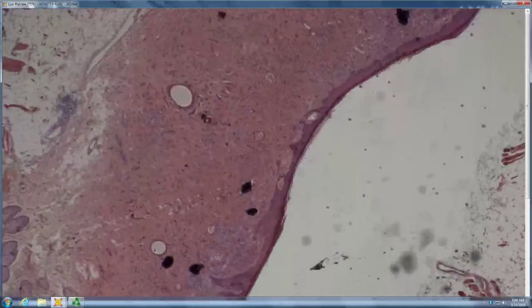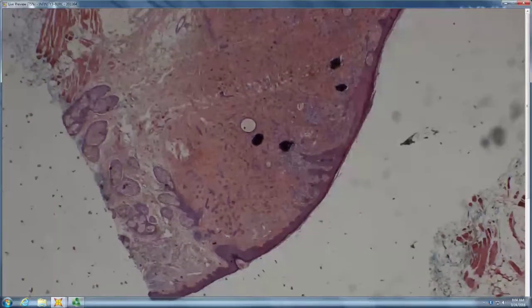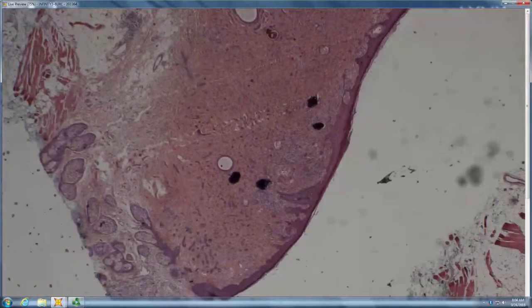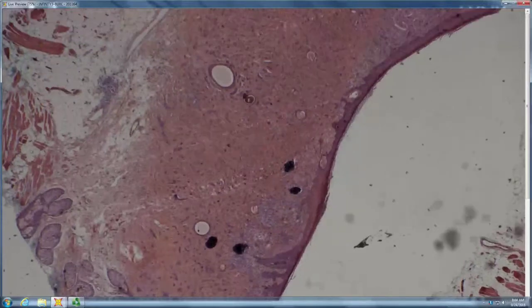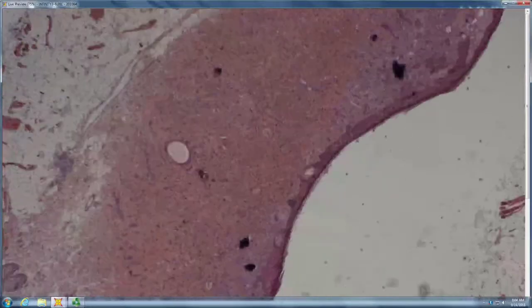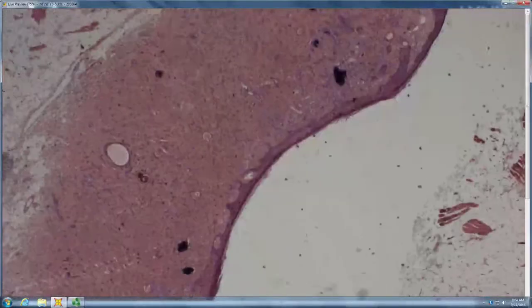Needs to be a little effacement of the epidermis. I don't know what those black things are. If that's artifacts. So that's probably calcium. And there's some kind of spiky little islands. So little islands in the desmoplastic stroma.